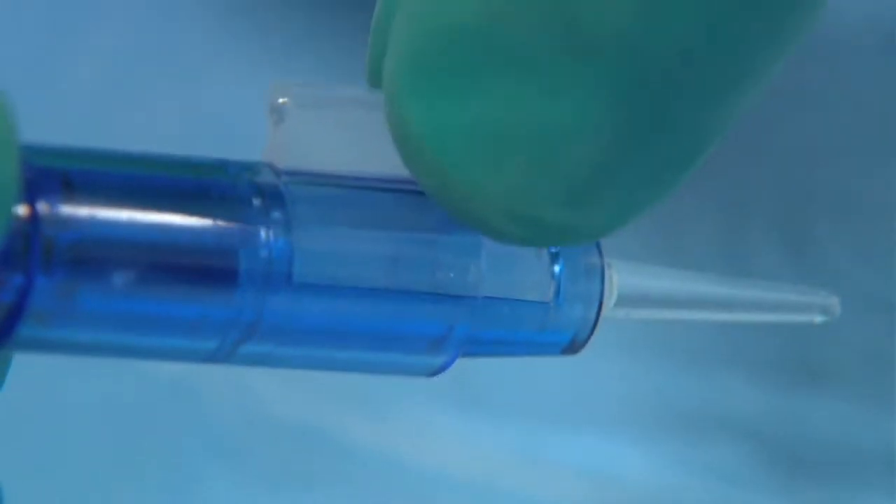The piston is perfectly positioned in relation to the cartridge opening, and the cartridge itself, as well as the injector, are both easy to manipulate and simple to use during surgery.